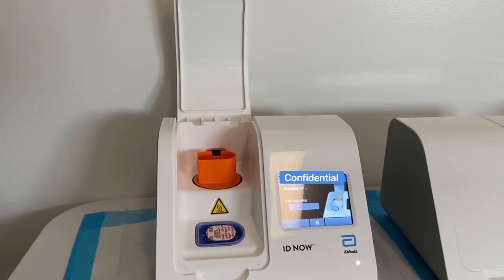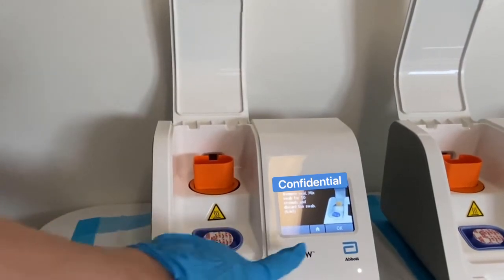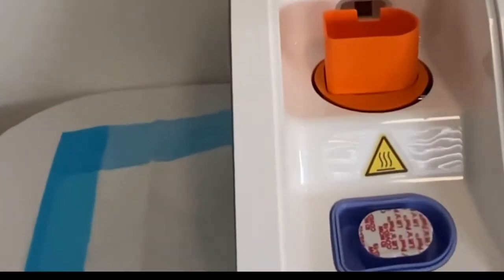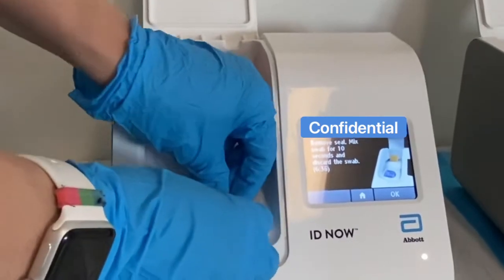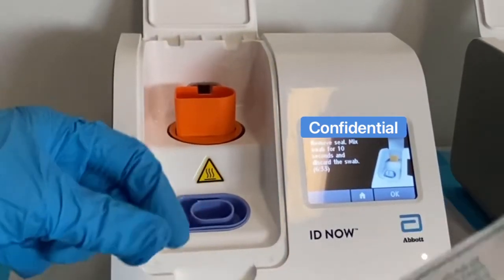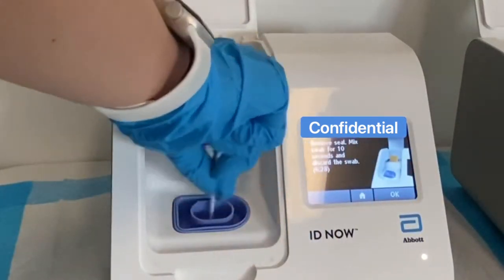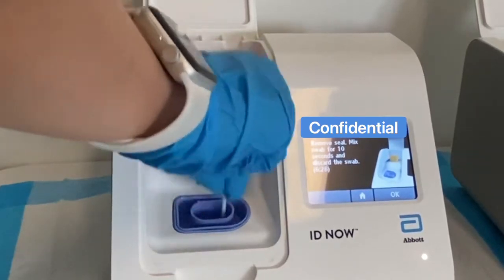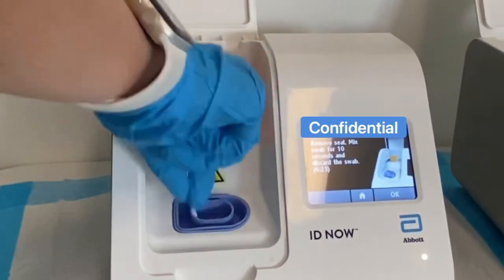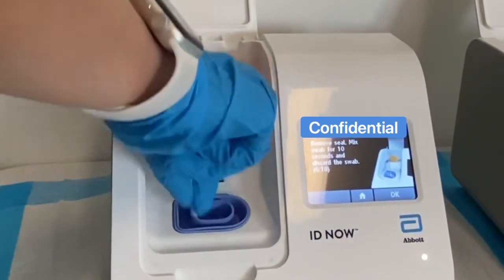Fast forward three minutes, and now you have the blue sample port right here, which is fully warm for your sample — the swab, of course. It says to go ahead and remove the seal and mix the swab for 10 seconds. Be careful not to accidentally spill it when opening or swishing it around. You want to fully count 10 seconds and make sure the sample is fully incorporated into the fluid, so that's why I'm stirring like this.